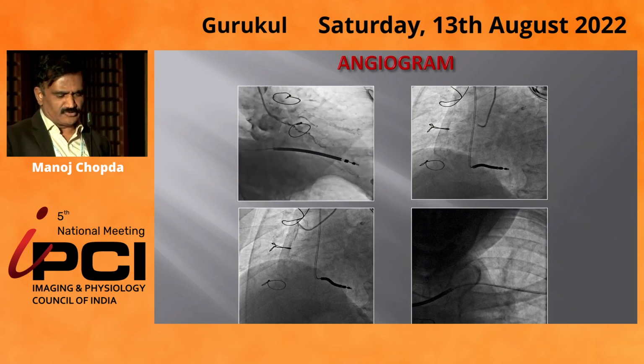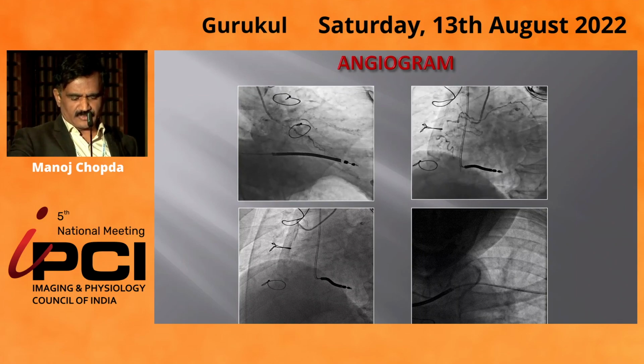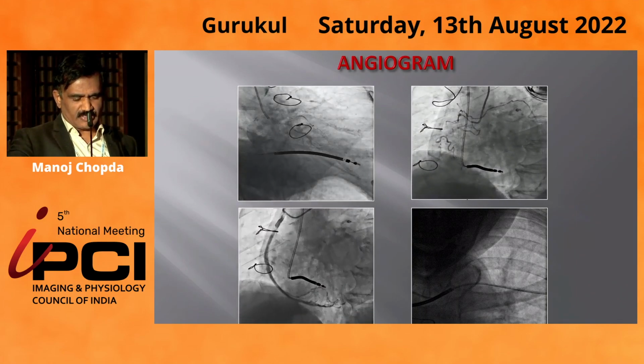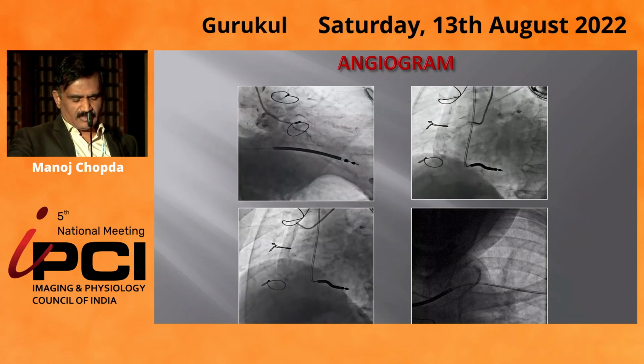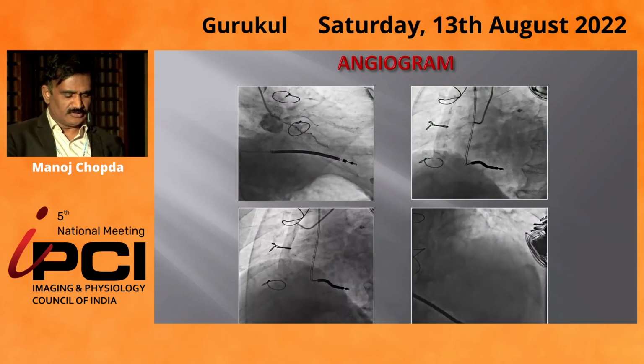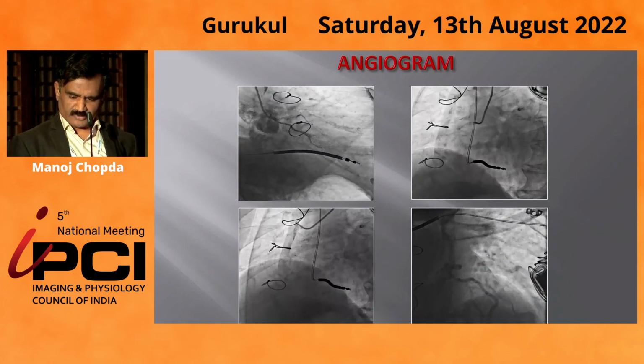This was a native angiogram, no LAD, only ramus was filling. RCA mid segment 100% occluded. And this is the SVG graft showing a very tight 95% lesion, negative shadow in the lesion, and a lot of calcium. And the LIMA to LAD was patent.